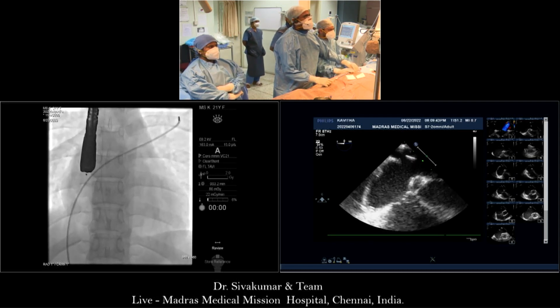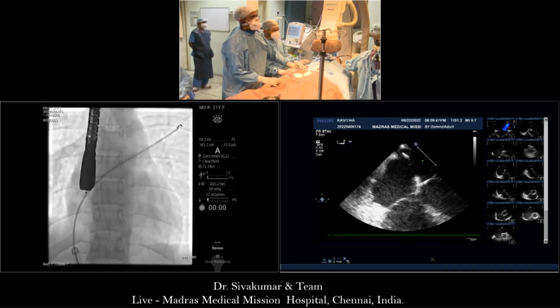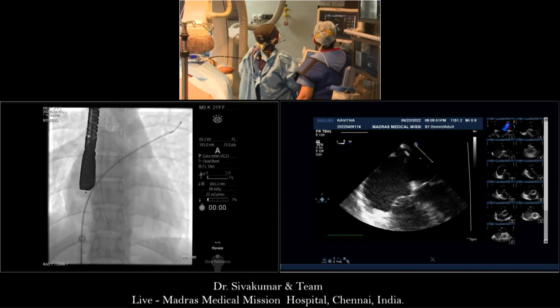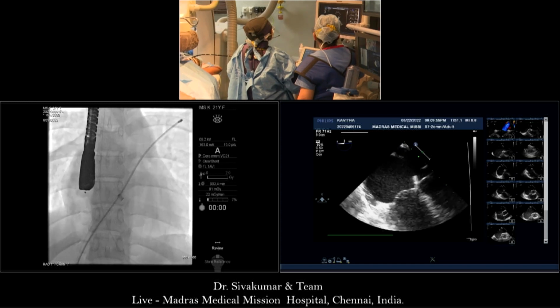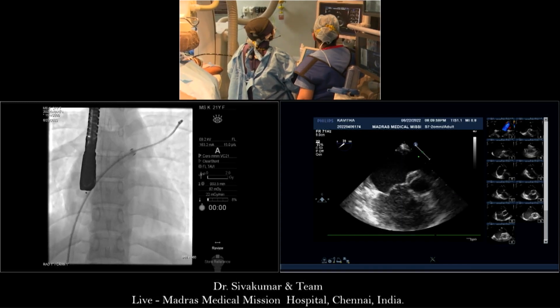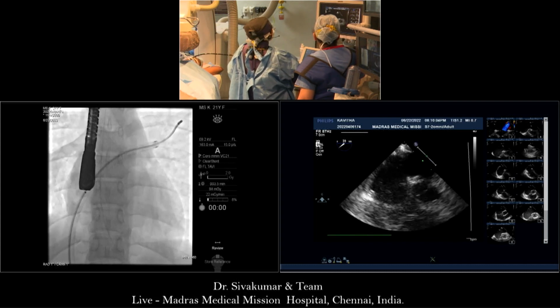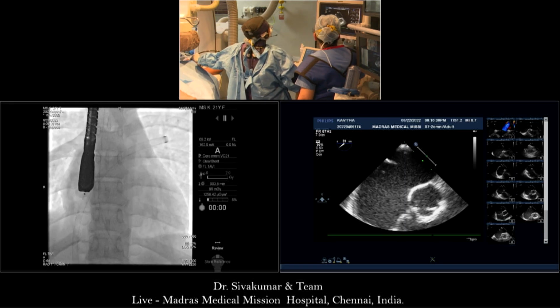Microphone. In this patient, use the microphone, Peter. Can't hear. What would you do if you now in Madras have a DOE? So what would you say? There is of course one plane. I think this is a very difficult case. I don't know whether it is possible to put any device in, but without any balloon testing, you just can have trial and error.